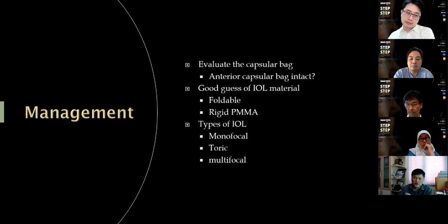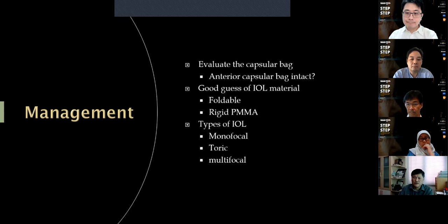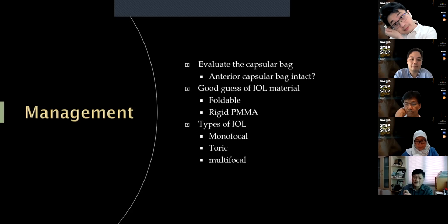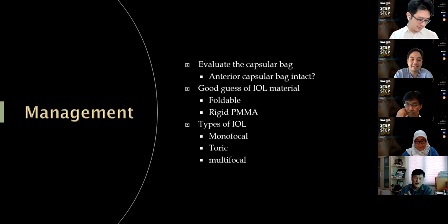I also want to find out whether the subluxated lens is a monofocal lens, a toric lens or a multifocal lens. This is also important because usually I will find out from the patient whether the patient could see well before the lens was subluxated. If the patient could see well, and the patient had a toric or multifocal IOL implanted earlier, then I have to explain to the patient to give a realistic expectation, so that after the surgery, likely the patient will need to wear glasses in order to see well, unlike before where they could see well without glasses.